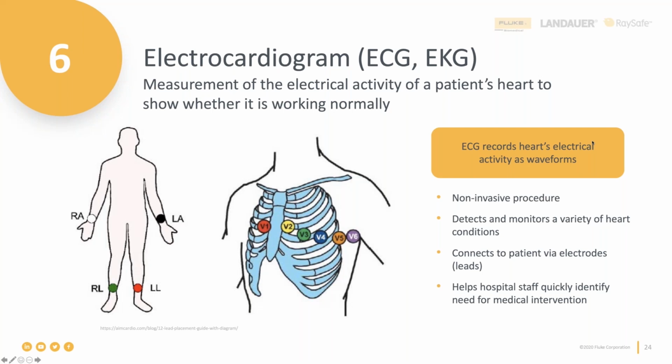such as, for example, arrhythmias. And ECG, in fact, is considered to be one of the most productive investigations in medicine, which is why it is essential to ensure the correct performance of your ECG devices. In a nutshell, ECG is a non-invasive procedure. It's a diagnostic medical appliance that is connected to a patient via leads, or we also call them electrodes, that record the findings in the form of waveforms. And for truly effective results, an ECG must be recorded in the most accurate way possible.